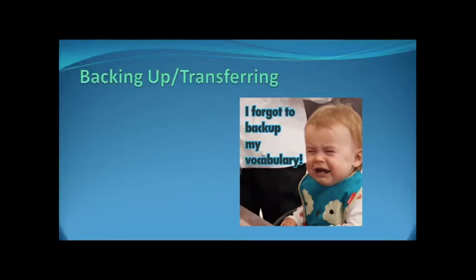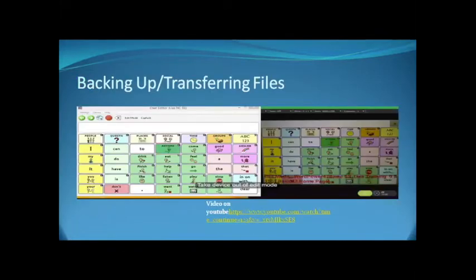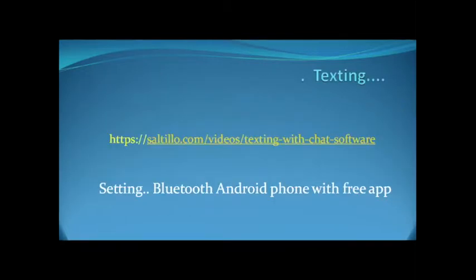We have a lot of students who might get trials on the Touch Chat app, and then when they get their own device, they've already done all the programming. So it's really easy now. There's also a video here on backing up and transferring files, so you can watch that at your leisure.